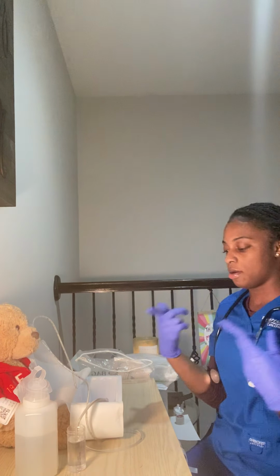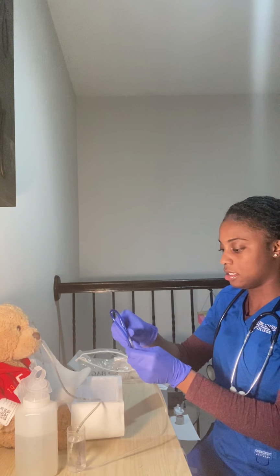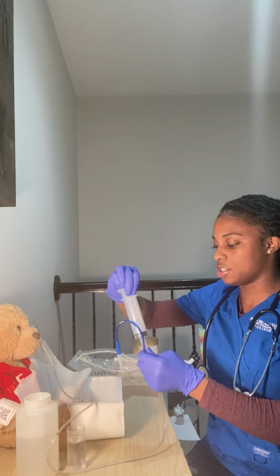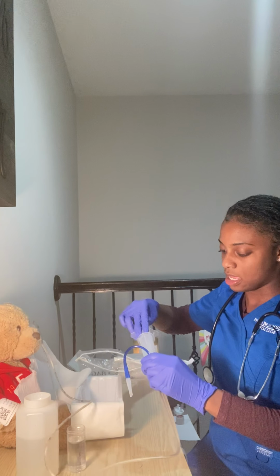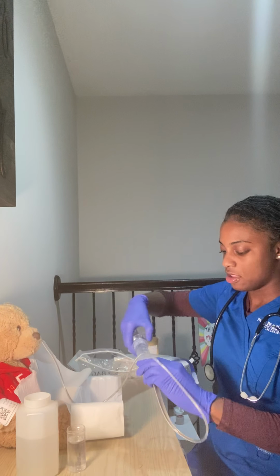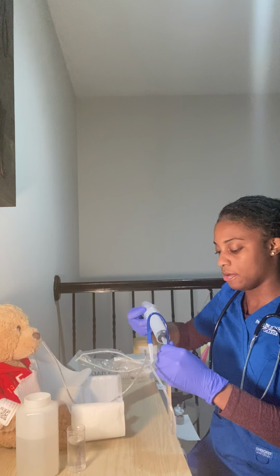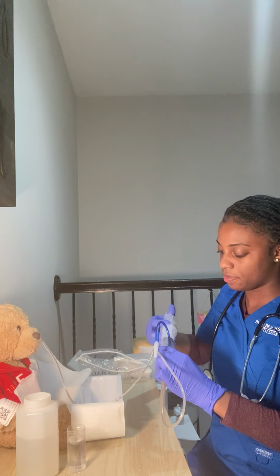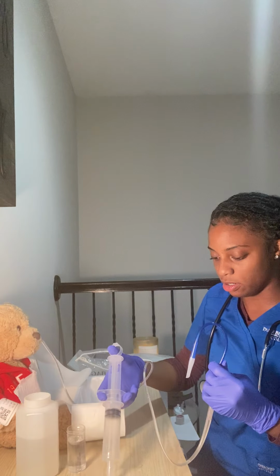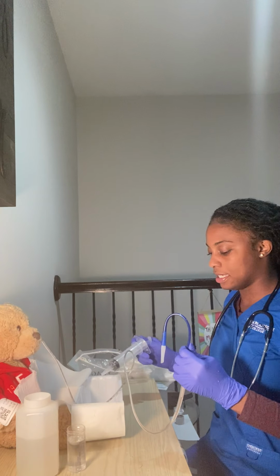I can do an x-ray, or I can also just go ahead and pull back some of the contents of the stomach using my syringe. I'm gonna pull back some of the contents, and I'm getting, oh wow, I'm getting a lot. I got about 50. So I'm just gonna go ahead and discard that, push that into my basin. I'm gonna go ahead and do it again. I got another 50. Before I push it all back into my basin, I'm gonna drop a little bit on my pH paper. I've got a pH of 3, so I know that it's in the stomach.